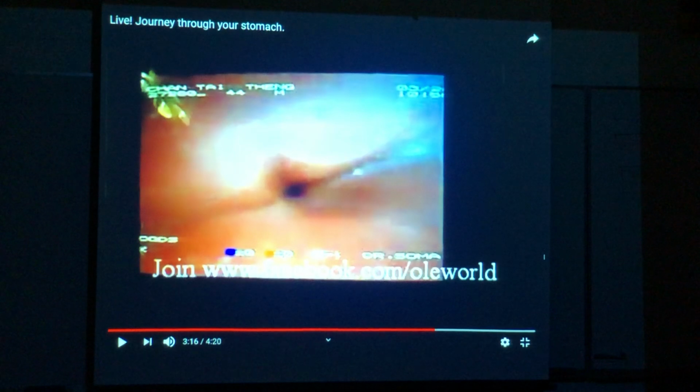Coming out. Now I'm at the cardiac junction. See that bluish stuff? That's mucus, so it's evidence of lots of mucus in the esophagus. As they pull the camera out, realize the esophagus is trying to close up and suck around the camera, because remember, it's not a big open airy tube. It's only large and expanded because they're pushing gas down your digestive tract. You're a big bloated patient right now, full of gas.